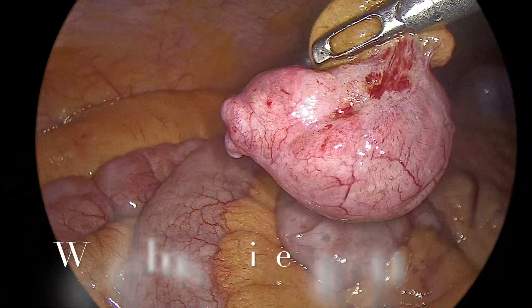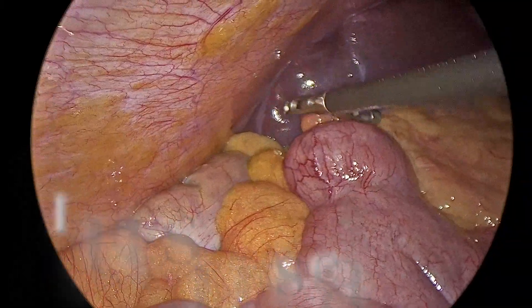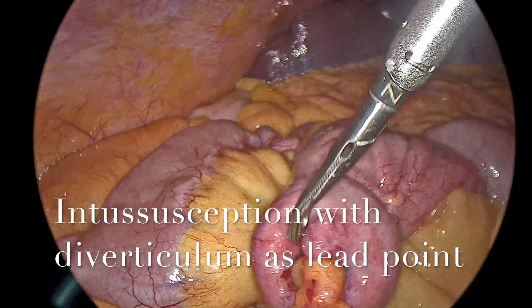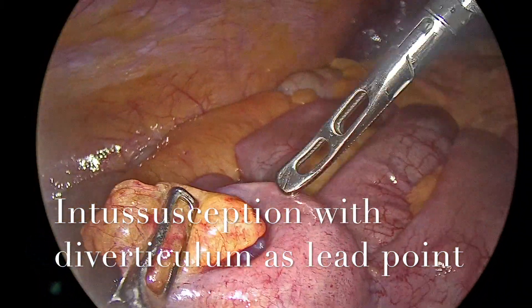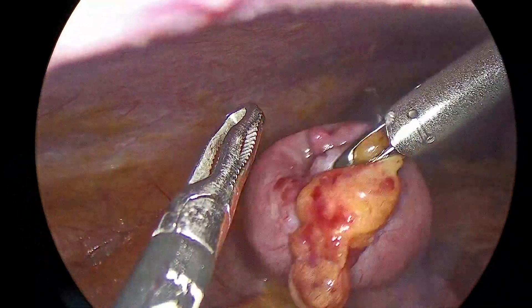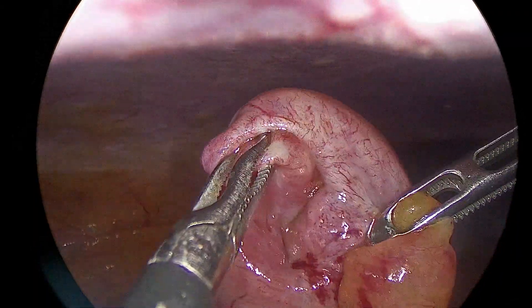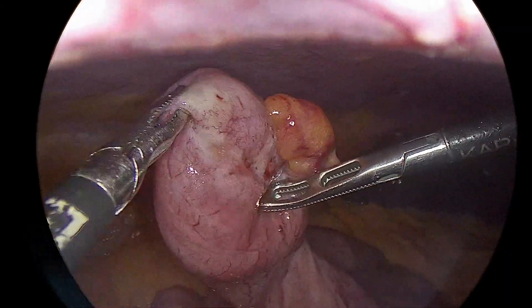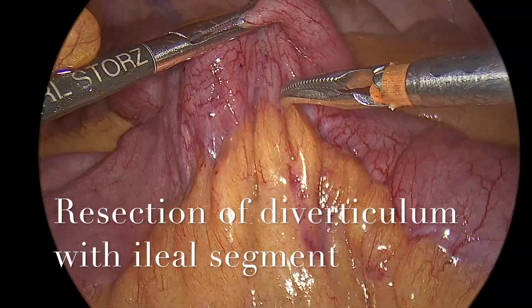This is the Meckel's diverticulum. You can see it is a wide-based diverticulum, and interestingly, the diverticulum is acting as a lead point for intussusception — which is why this was causing recurrent intussusception and pain in this patient. Recurrent intussusception was the main presenting symptom leading to pain, and since it was wide-based with intussusception, we planned to do an ileal resection, resecting the segment of ileum containing the diverticulum.